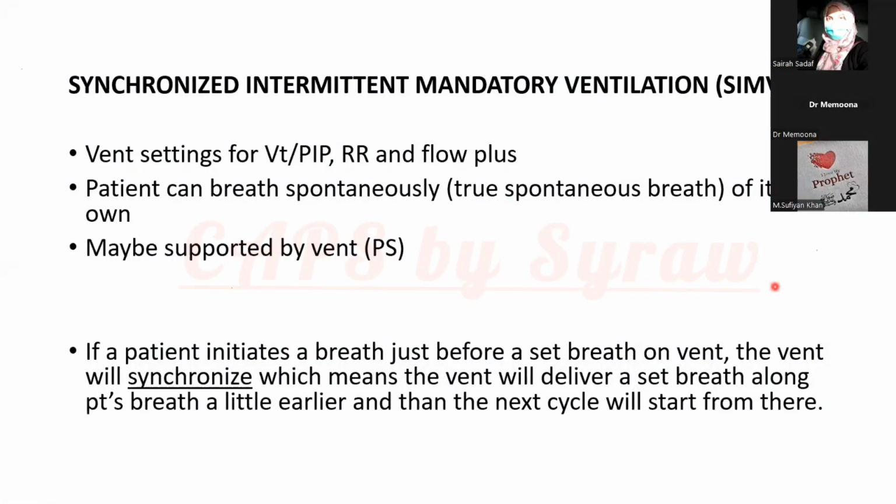This is another mode, synchronized intermittent mandatory ventilation or SIMV. Here we will set either the tidal volume or the peak pressure, depending on whether it is PC or VC, and other variables just similar to the assist control mode. The patient can breathe spontaneously. The patient can have true spontaneous breaths of his own.